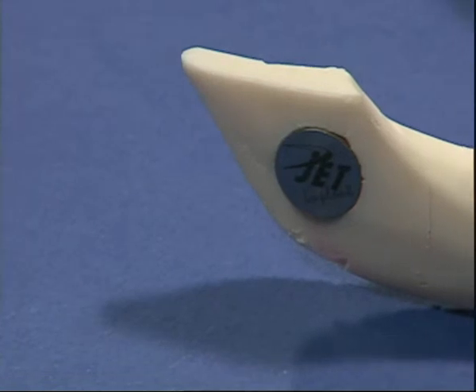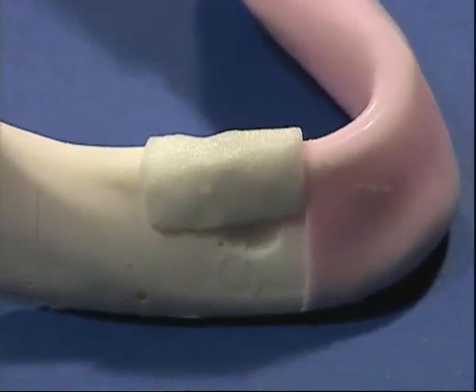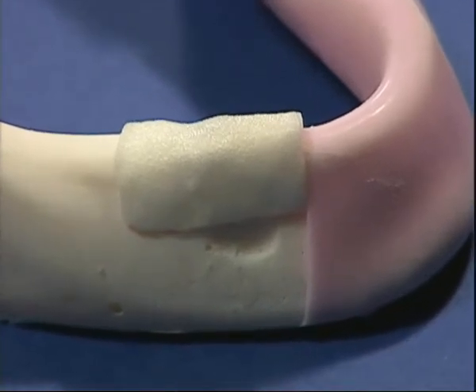If you measure the spaces in the membrane under a microscope, you will find that these are smaller than the cells, and so they are able to block the passage. The membrane remains intact for at least 4 to 6 weeks.